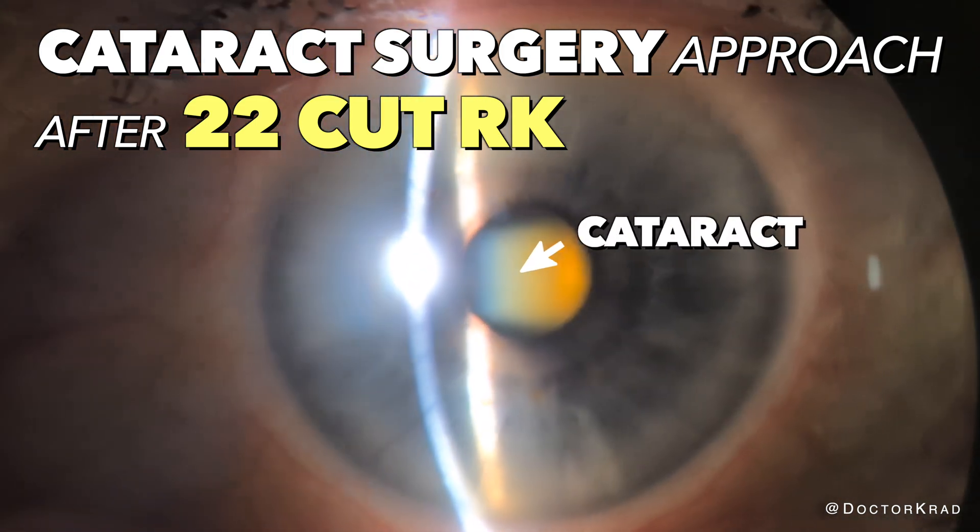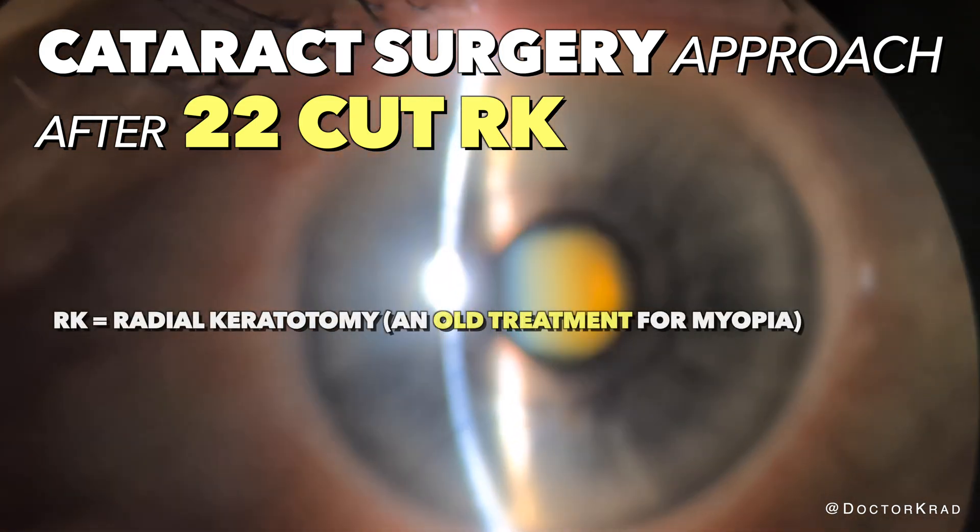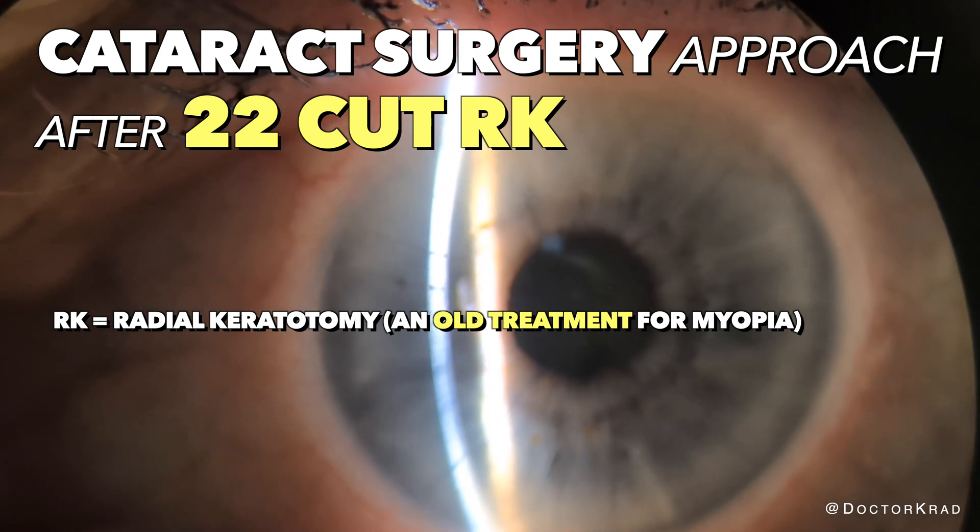Hey everyone, it's Dr. Cradd. Today I will be performing cataract surgery for this patient with 22-cut RK.